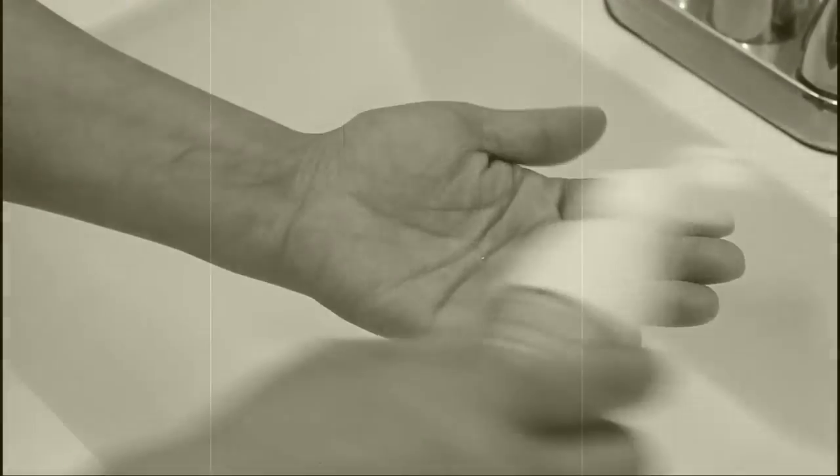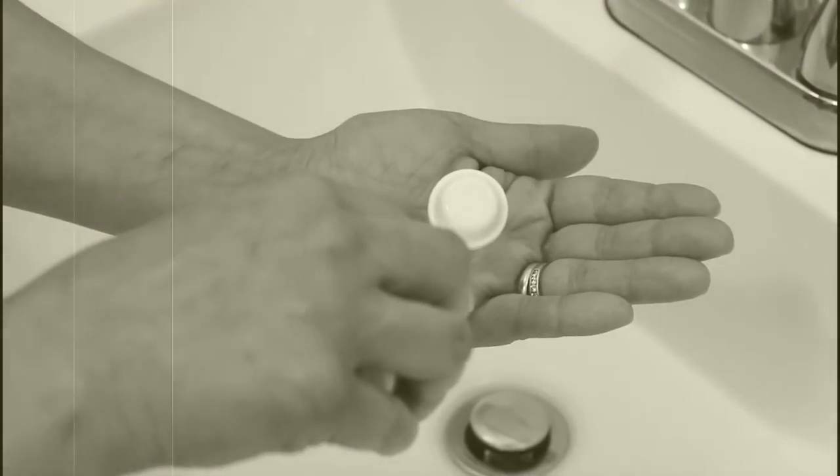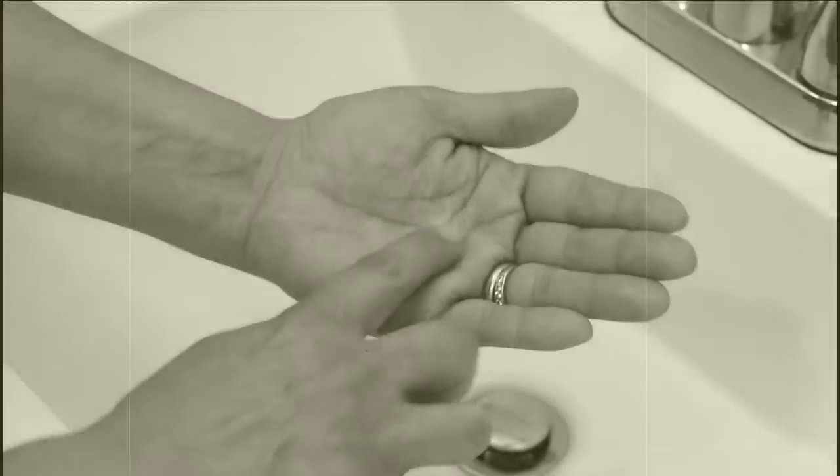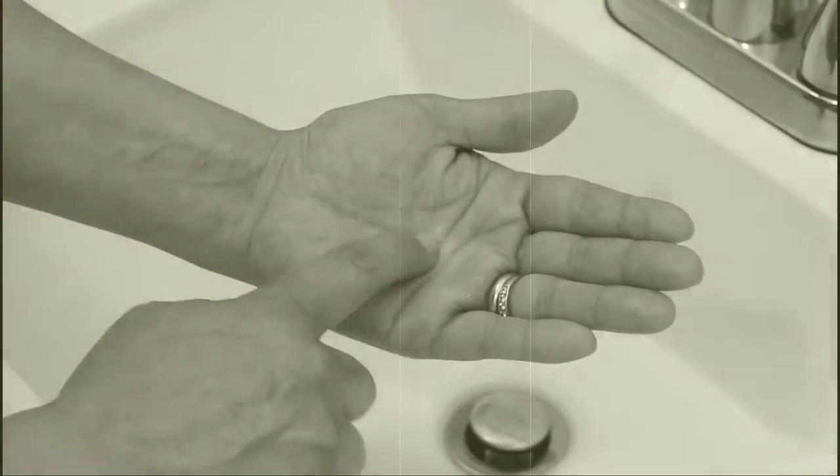The traditional way to disinfect contact lenses is to place the lens in the palm of the hand and rub. This is time consuming and often leads to torn, frayed and damaged lenses.